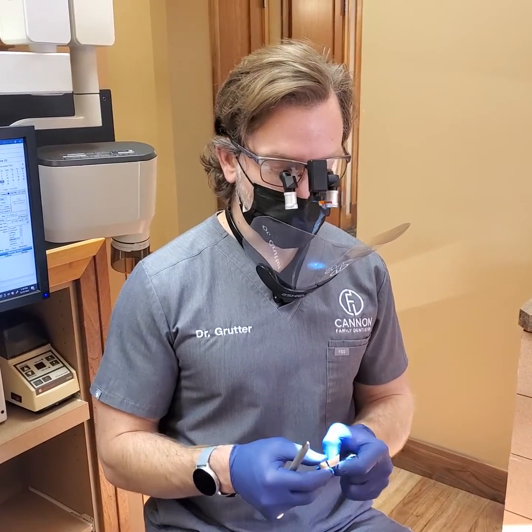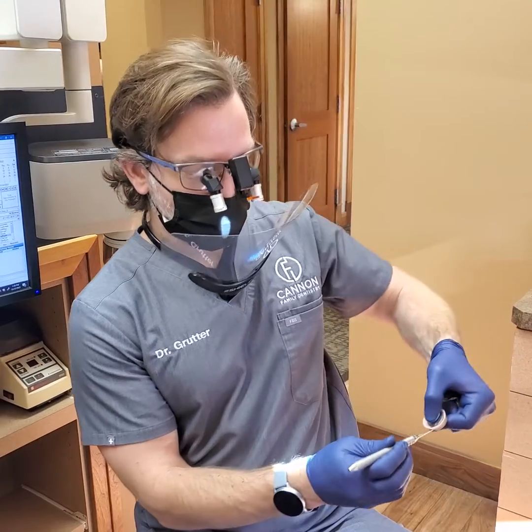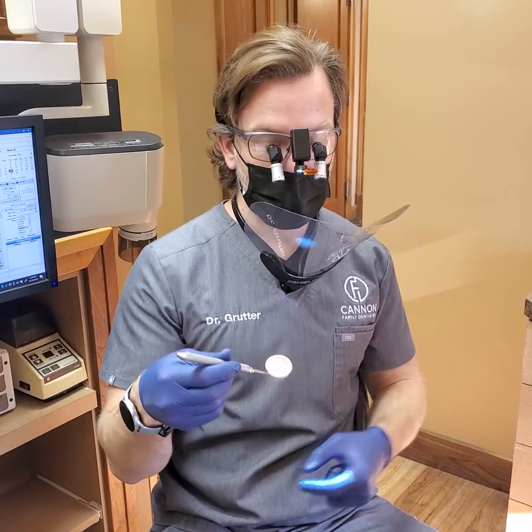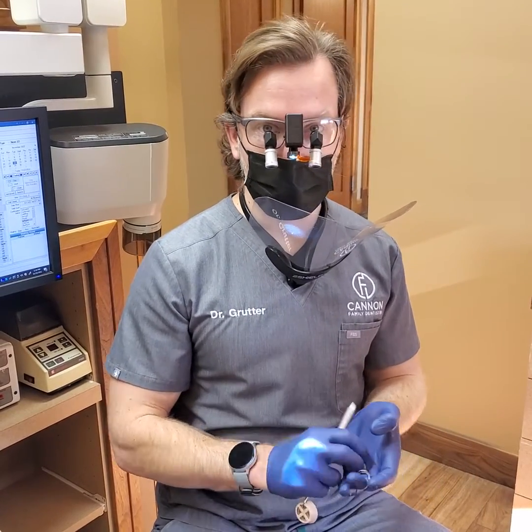In the interest of avoiding such an incident, I created this where you take any mirror, slide it on here, and it just pops right on. Now it's created a little basket. So as I'm in the mouth, if I do drop it, at least I've got a chance at catching it inside here. It's not that it's going to catch anything, but it will give us a little bit of increased safety.